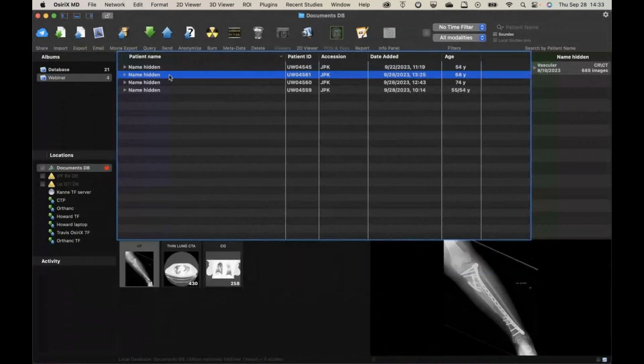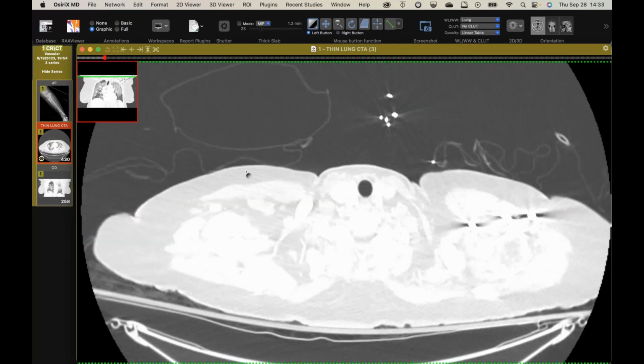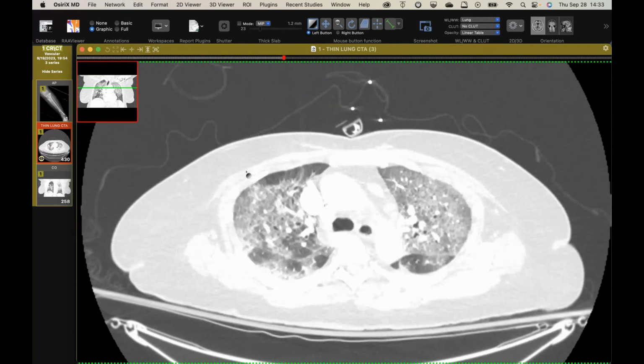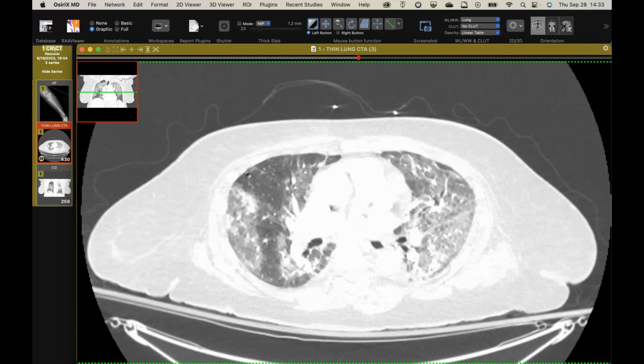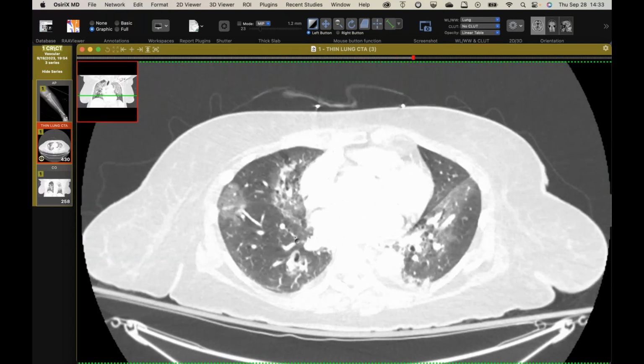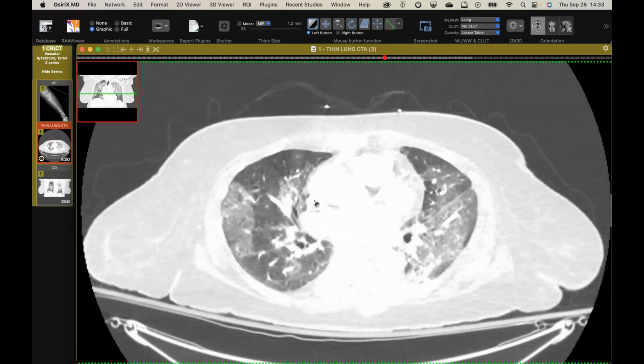This next case is cool. My colleague Mark made a great diagnosis. So this patient, this was to look for a pulmonary embolism with shortness of breath, and it just had surgery. And it's always good to know what kind of surgery people had. And you can see on the study, there's this upper lobe ground glass opacity. It's fairly extensive. Kind of looks organizing pneumonia-ish. It's got discrete areas, crosses the fissure fine. So great look for acute lung injury, organizing pneumonia pattern.